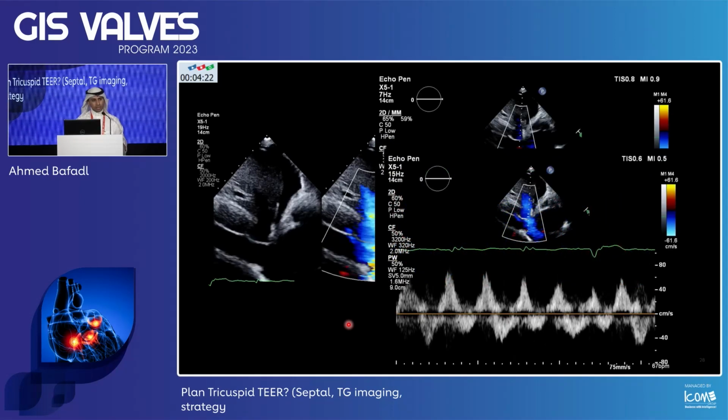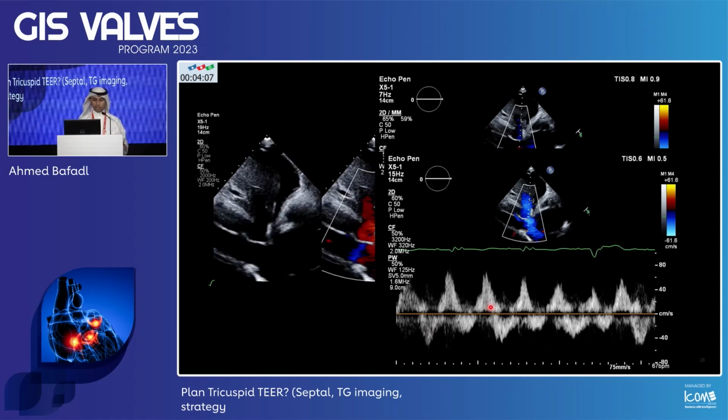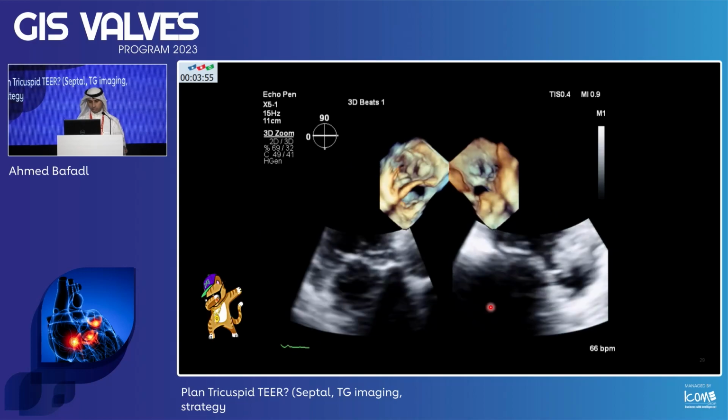Here, that patient, when we scanned him, you can see the hepatic vein reversal, but it went to what? A rhythm issue. So here is like 2-to-1 atrial flutter, and you can see the reversal. So in this view for the images, if you want to comment on the hepatic vein systolic reversal, make sure you don't have AV dissociation, you don't have arrhythmia, and you don't have ventricular pacing, because that will give you a fake hepatic vein reversal.